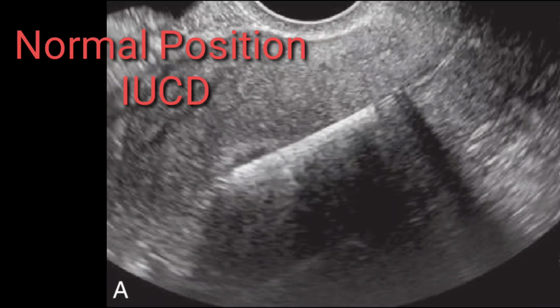If in that case you are not able to appreciate it on either transabdominal or transvaginal scan, for that purpose you need to have an X-ray abdomen or X-ray pelvic cavity, so X-ray will pick up all these IUCDs.